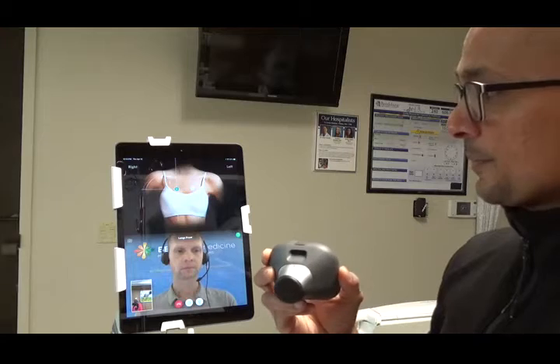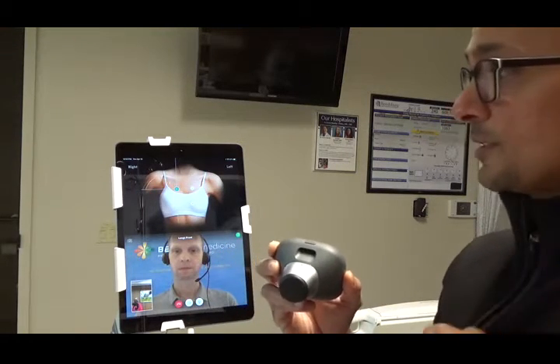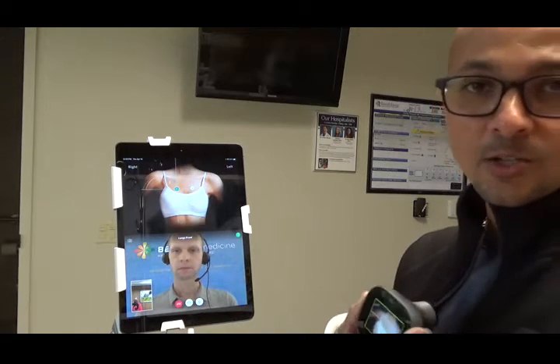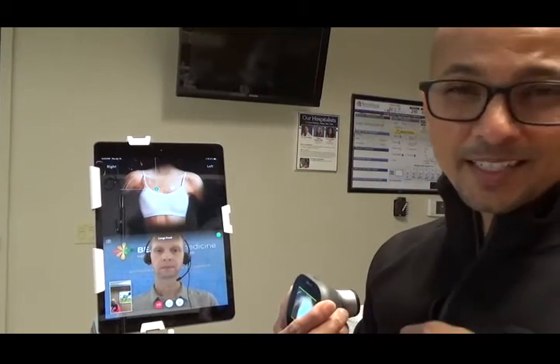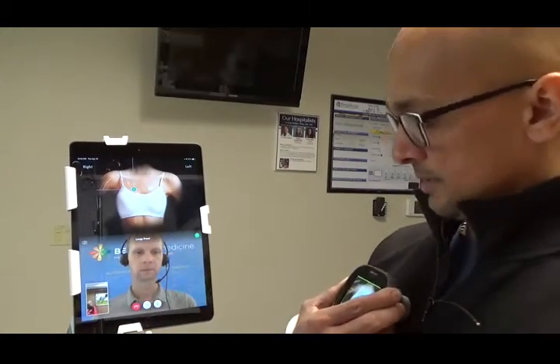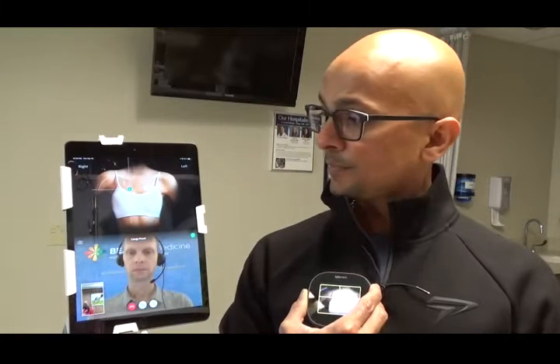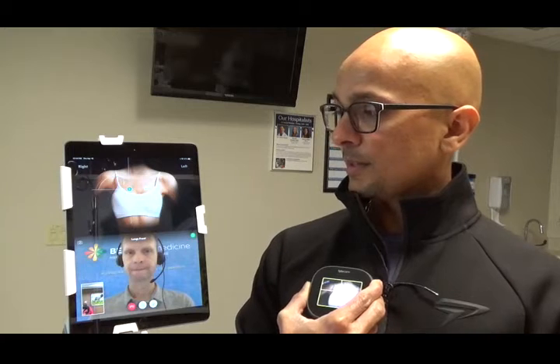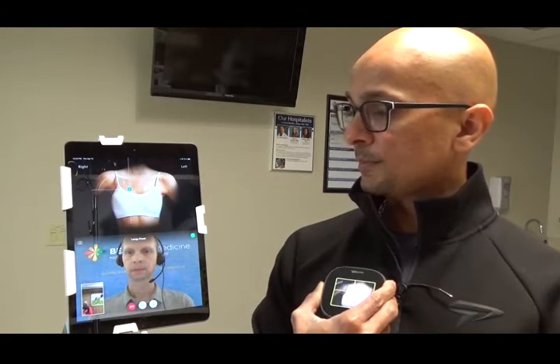So we did this. Now, it pretty much tells us where Dr. Scholes wants us to put it in terms of location. Now, usually you want to go at least T-shirt or direct to skin. I think the sweatshirt is a little bit too much, but anyways. So Dr. Scholes wants us to listen at number 1. So that's 1. Good. And then if he changes the number, it will show up on here.